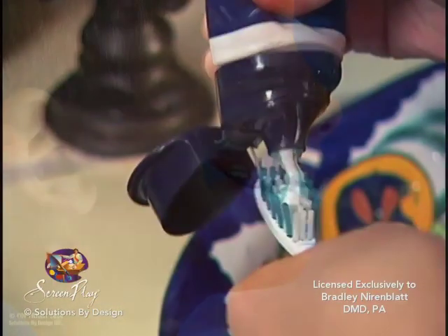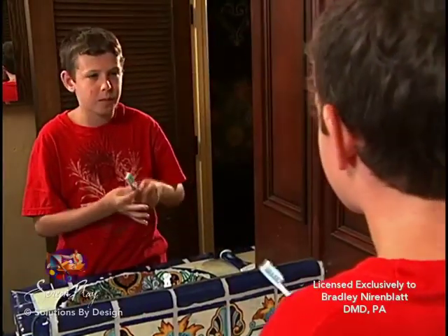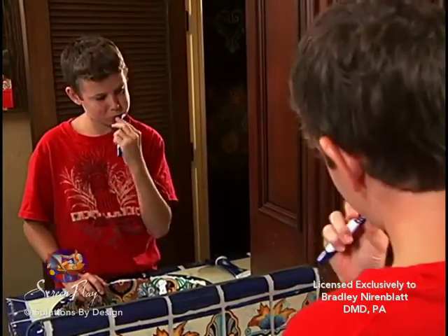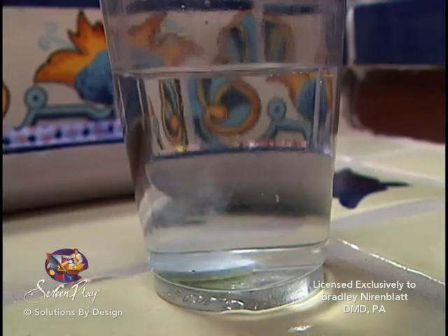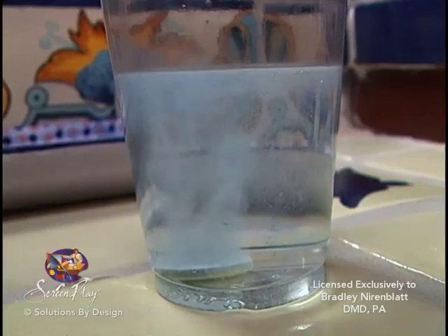After each meal, remove your plates and brush your teeth as well as the inside and outside of your plates. Then rinse the plates and your mouth before replacing. To keep your twin block extra clean, you may soak your plates in denture cleaner such as Polydent for five to ten minutes in warm, not hot, water. Rinse your plates prior to replacing them.